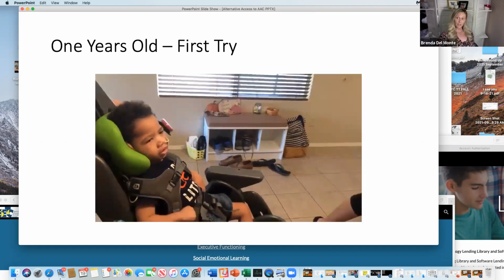So what I do when I'm setting up with a person with 2-step scanning is I put the red on... stop, no, that's not it. Not that one, not that one. And I put the green on, that's the one. And I do that as much for my team as I do for the child, because they honestly can't really see the pictures from where they are, especially if they're using their head. But then I take pictures of exactly where I put the head and where I put the switches, and they all know the red is the scan and the green is the select.